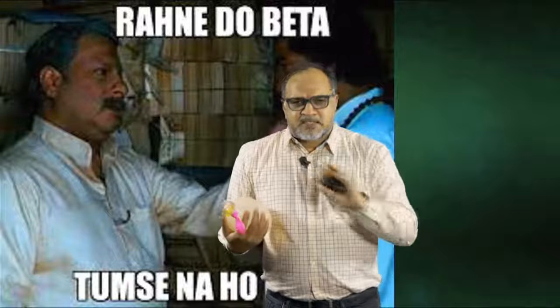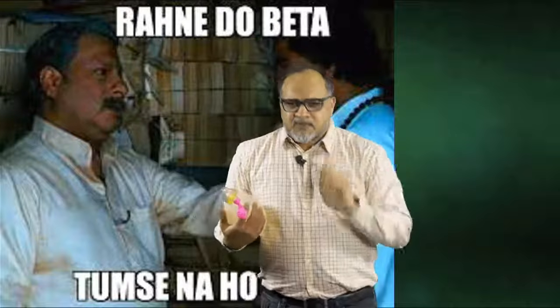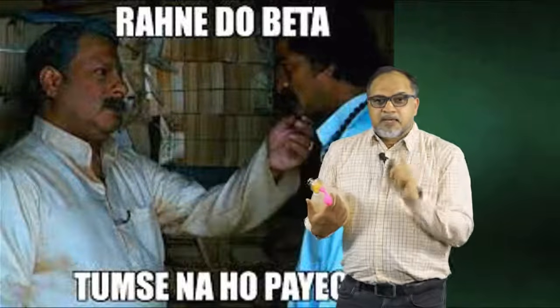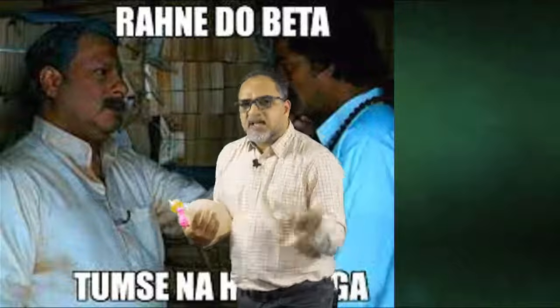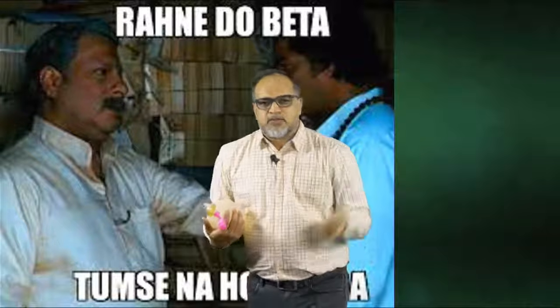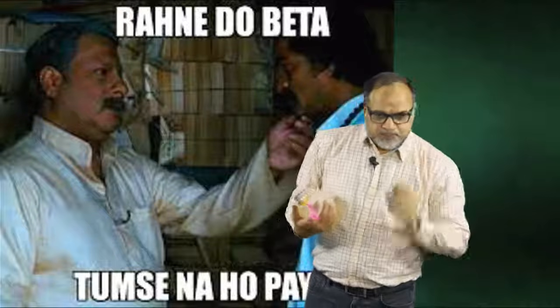So CMV was good, but it has its lot of problems. ACMV was better, but with slight problems of hyperventilation. PSV was wonderful, but the patient needs to be conscious and awake. Nowadays, all these modern ventilators have a backup mode. If the patient doesn't breathe well on the ventilator, they go to the apnea mode or backup mode. So whenever you put a patient on PSV, you have to set the backup settings also.